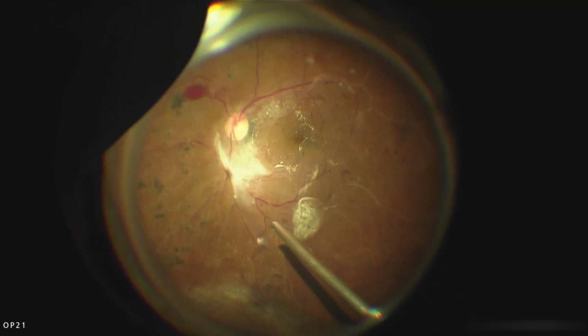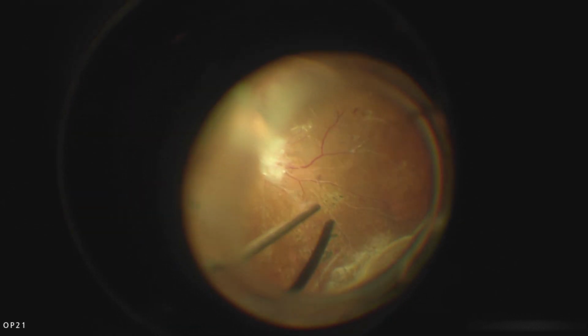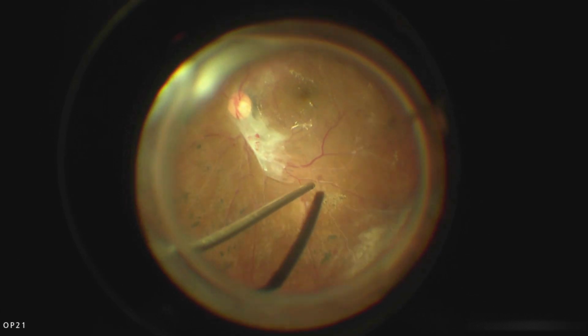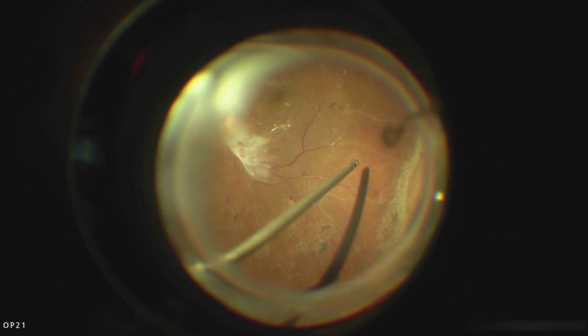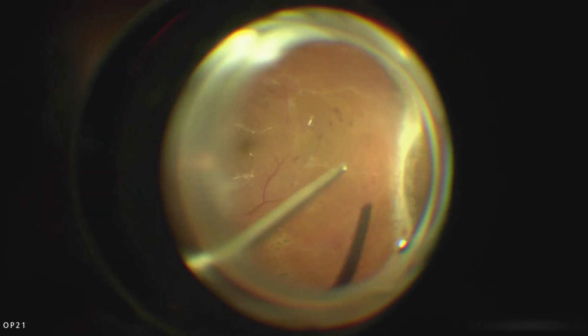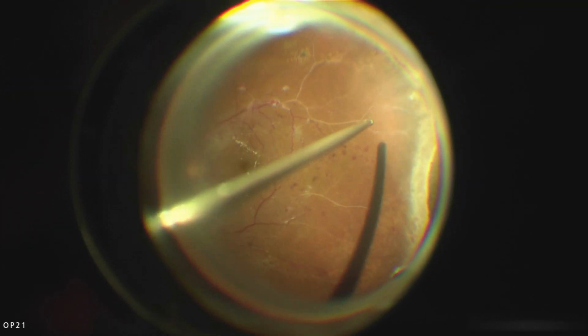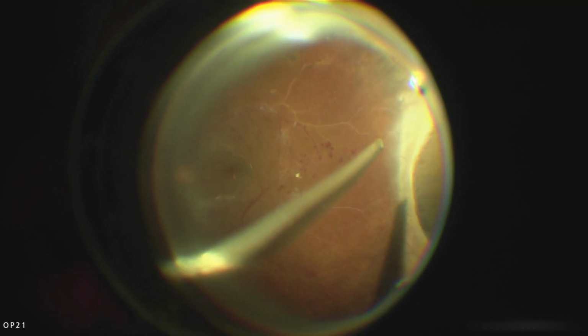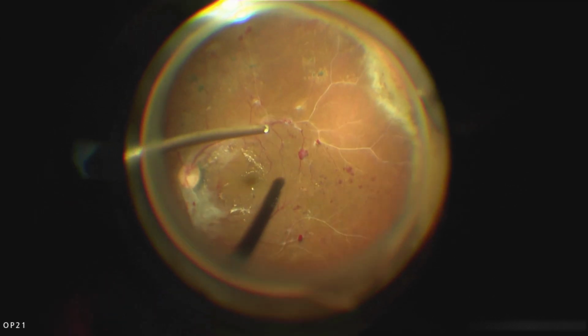and continue on to a 360 degree detachment of the posterior hyaloid. It's quite vital and imperative here to make sure that one doesn't just aspirate the vitreous, because it will cause a tear. It's important to continue to cut it, and with the 20K cutter that I'm using here, the retina is extremely stable. You can even direct the opening of the cutter towards the retina, and it is very stable, doesn't really pull on it.